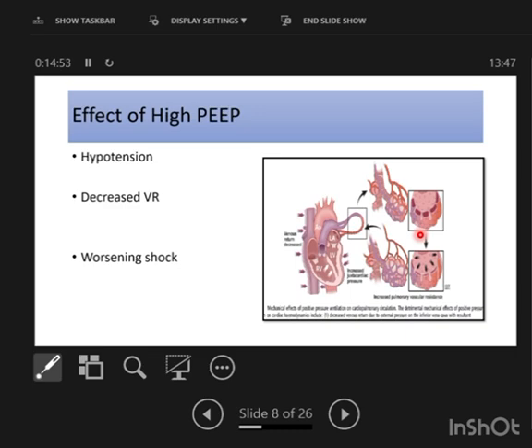At the same time, even if the respiratory rate is high, there will not be air trapping in ARDS. Why? Because the compliance is so low, the expiration occurs so fast, deflation occurs so fast. The balloon is difficult to inflate, and it deflates fast also. So you don't require a long expiratory time. That's why you can go to a high respiratory rate, because there is no risk of air trapping. On the contrary, like COPD we have discussed.